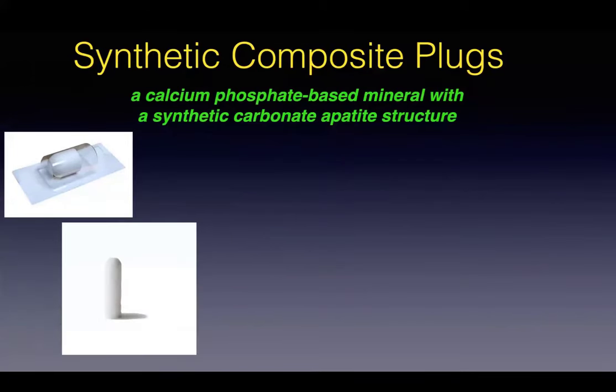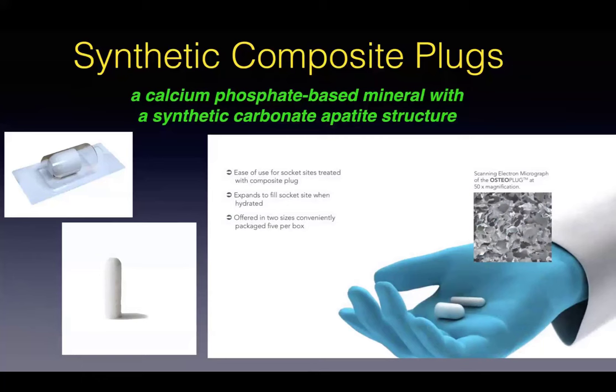Synthetic composite plugs. These go by different names depending on who you purchase them from. But one thing they all have in common, they're typically made up of about 80% calcium phosphate and about 20% of bovine tendon collagen. And they expand once it's hydrated. There's another one out there that's kind of more of a sponge matrix, cross-linked collagen linked by hydroxyapatite and a sugar.